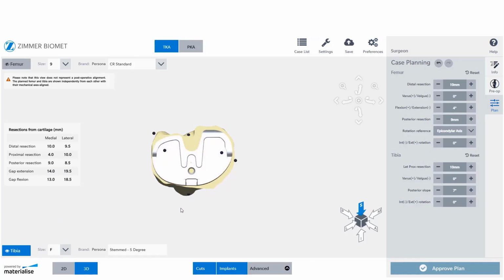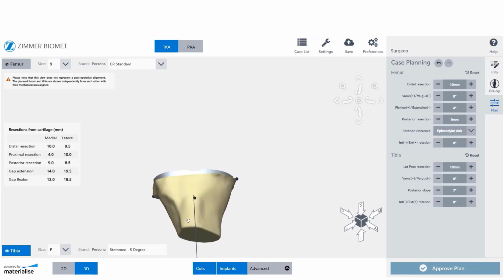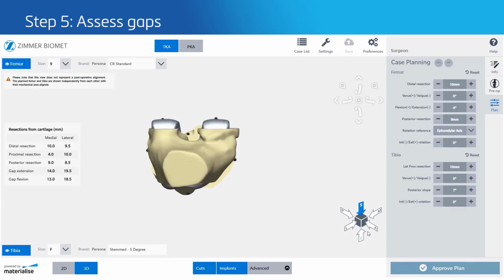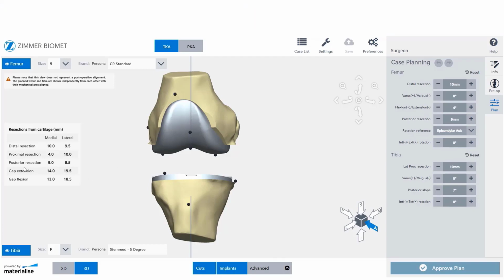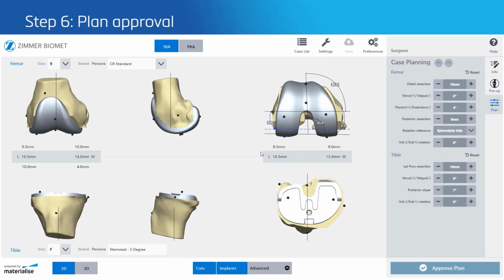You can do a final check on the tibia position in relation to possible presence of osteophytes by moving the tibia in 3D. During planning, you can always review the impact of your changes on the flexion and extension gaps in both the 3D view and the 2D view. Note that there is no information on soft tissues included.